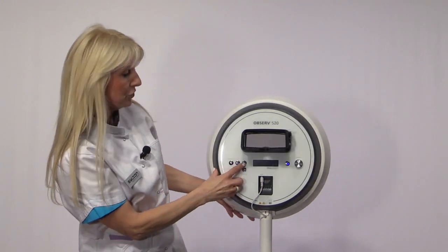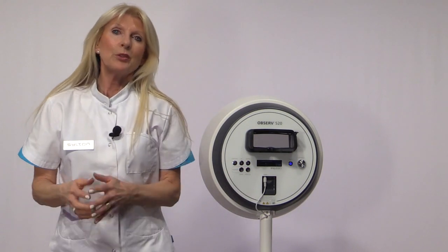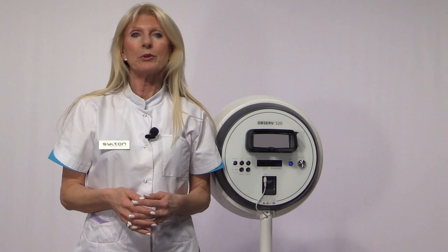And now for the woods mode, which is this one here. The woods mode is very similar to the UV mode. It is also based upon the principle of skin fluorescence. The difference is that in this mode, the light spectrum of a classical woods lamp is simulated. Now the woods lamp has been used for over 100 years by dermatologists and skin therapists to identify skin concerns. In this mode, the Observ simulates the classical and well accepted woods light.